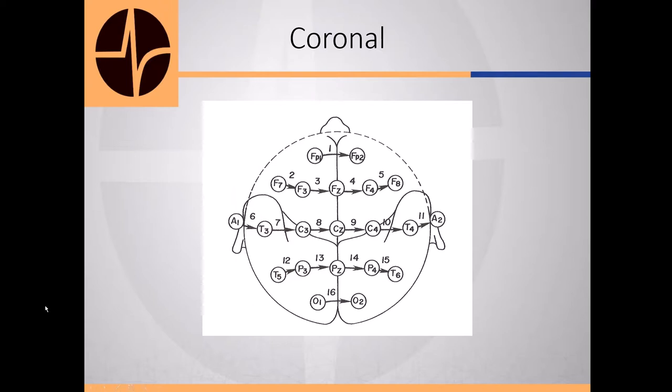This is a coronal. This is the front to back, so it's left to right, left to right, left to right, left to right. So it's good to tell the difference between front and back, but not between left and right.